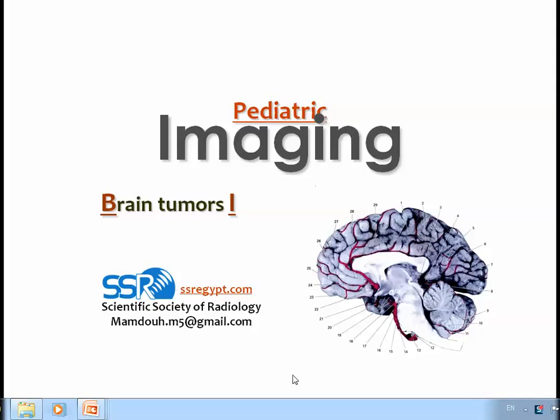Dear colleagues, we are continuing the pediatric imaging series. We have finished with the brain normal anatomy, imaging of the hydrocephalus, imaging of neuronal migration disorders. And we still have some of the important issues in the brain imaging, and this is one of them, which is dealing with imaging of the pediatric brain tumors.